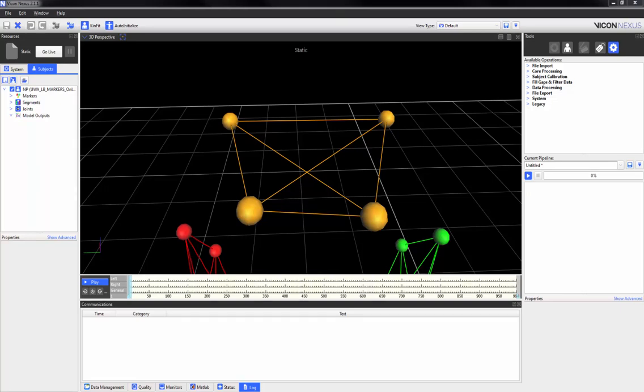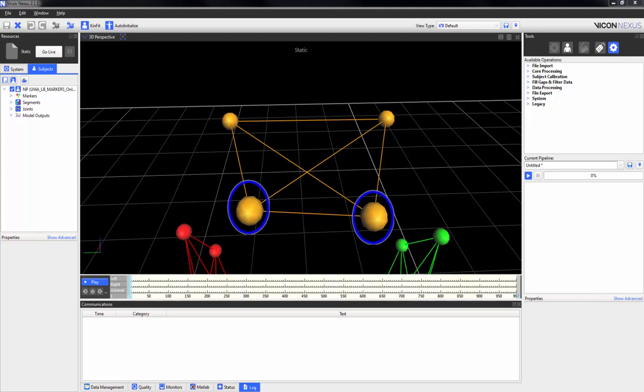Biomechanical modelling can also be done with Python, the free scripting language. Just like the MATLAB interface with Nexus 2, with Python you can edit the C3D file directly — for example, setting gait cycle events, editing trajectory and analog data, and creating model outputs. The advantage of Python is that it is free to use. In this segment I'm going to show you how to execute a simple Python script from the data processing pipeline, where a modeled marker will be placed between the ASIS markers and another between the PSIS markers.